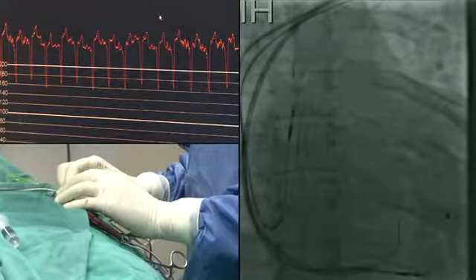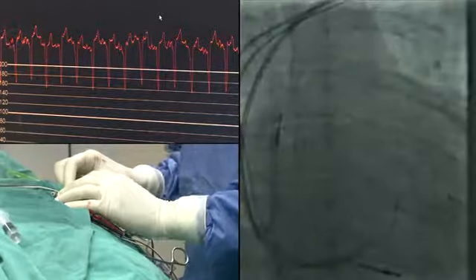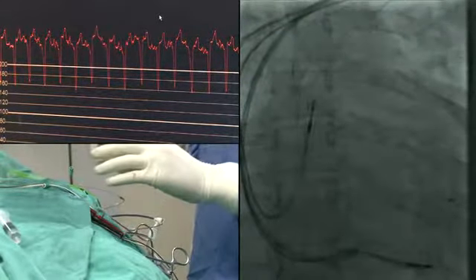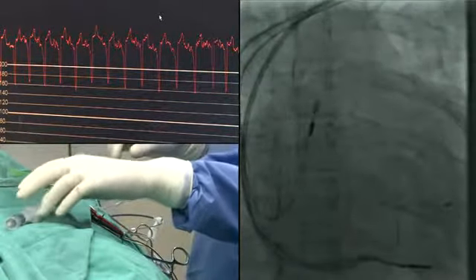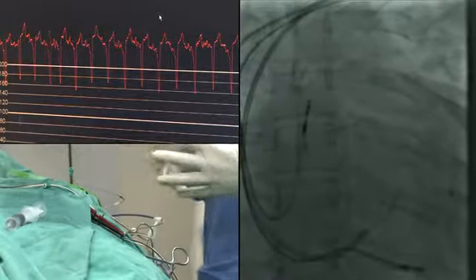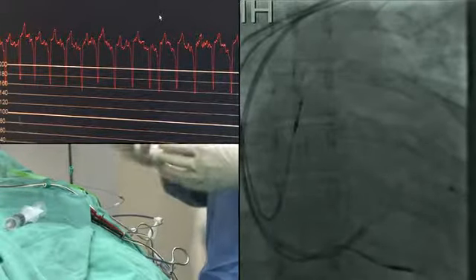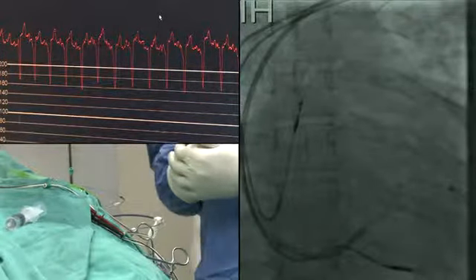The other option is endocardial LV pacing. We should consider this and discuss with the patient. But the epicardial lead has some disadvantages in the long term, and the endocardial lead needs anticoagulation. The best is to have a venous lead. This is the best.